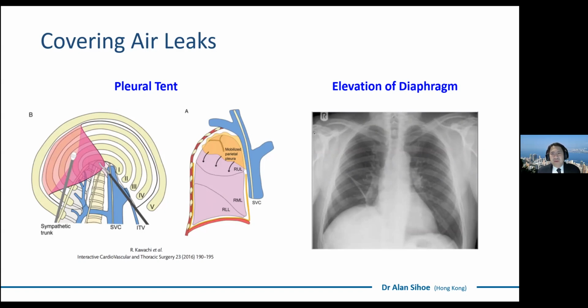However, most of you in the audience, I'm pretty sure, don't use these or use them extremely rarely. And of course, because today in the age of VATS, in the age of sublobar surgery, we're aiming for minimal invasiveness. And both of these are adding invasiveness and adding morbidity to surgery. So, instinctually, you don't really want to do these things. I mean, pleural tent, it's a pleurectomy. It's painful, for goodness sake. So there's a good reason why we don't do these very often.